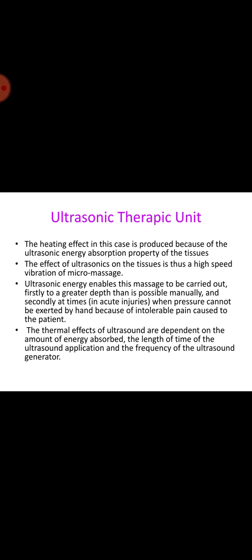Massage as a modality in physical medicine has been used in the treatment of soft tissue lesions for centuries. Ultrasonic energy enables this massage to be carried out, firstly, to a greater depth than is possible manually, and secondly, at times when pressure cannot be exerted by hand because of the intolerable pain caused to the patient.